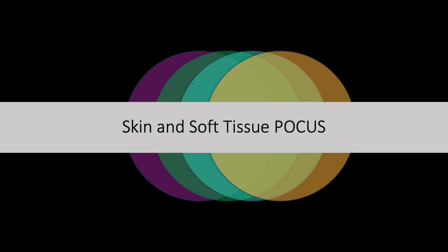This lesson will cover the highlights of skin in MSK-related soft tissue point-of-care ultrasound. The soft tissue structures we won't go over in this lesson are endocrine structures, vasculature, and ocular ultrasound, so expect these in another lesson. We will go over normal skin and subcutaneous findings, as well as some of the most common conditions encountered by generalists in both the inpatient and outpatient settings.